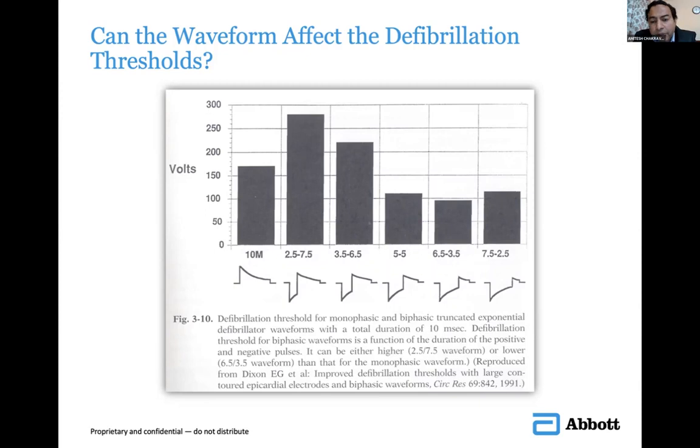See, every time you cardiovert or defibrillate, you are actually stunning the myocardium. They say that even if it's a matter of two cardioversions or defibrillations, the third will set the stage for myocardial stunning. That is, the heart might be getting weaker with every possible shock. But what to do? If you have a VF patient who is not responding, is unconscious, you don't have a pulse, you don't have a BP, you continue with CPR, you continue shocking till you have either some benefit or you have enough time to make sure that the acidosis or the electrolyte imbalance or whatever it is has been taken care of. There's something called a VT storm, but that is rare.